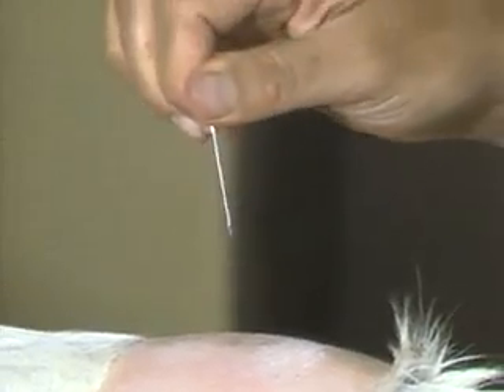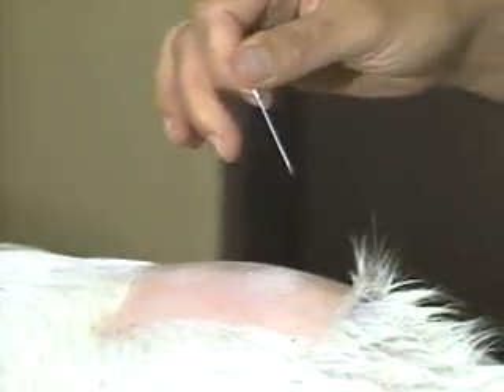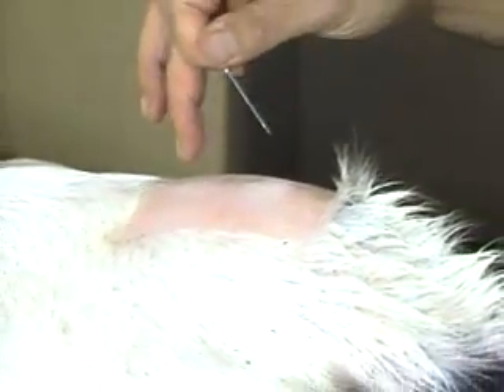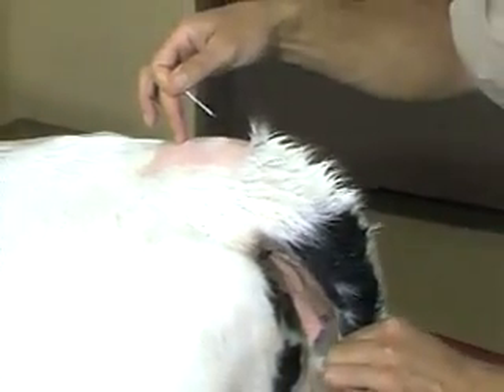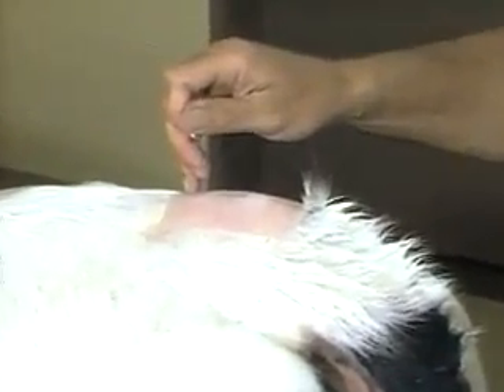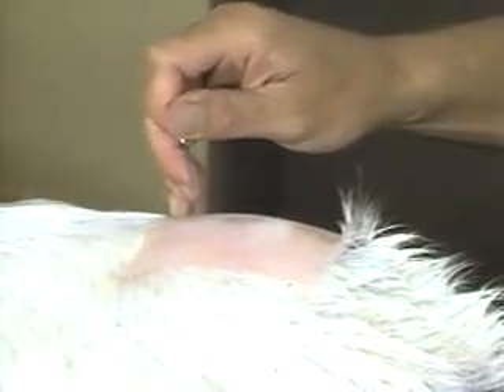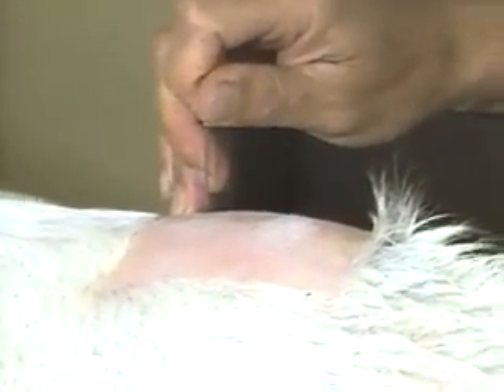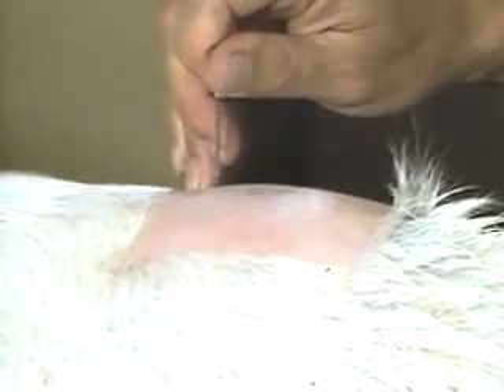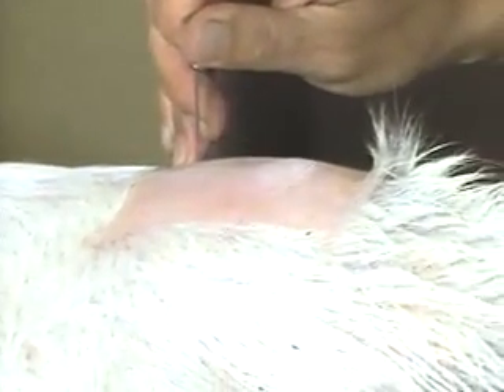The area is prepped with alcohol. Take an 18-gauge, preferably a one-and-a-half-inch needle — it could be done with a one-inch needle. It's helpful to identify the site one more time with a finger. Keep the bevel of the needle either directly anterior or directly posterior, and the needle goes in nearly perpendicular, but maybe slightly anterior-directed, precisely on the midline. Thrust it in.